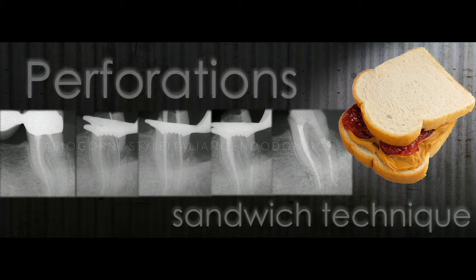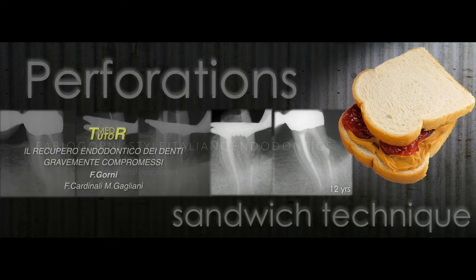So that's why we decided to treat the apical 1/3 with the normal technique, so cleaning, shaping, and packing with the warm gutta percha, and then pack the middle 1/3, all the middle 1/3, with the MTA in a sandwich. So in the apical 1/3 we have warm gutta percha, in the middle 1/3 MTA, and above the MTA we can put gutta percha, or like in this case, composite and post. So that's why the name sandwich technique. Now we can see the follow-up after 12 years.